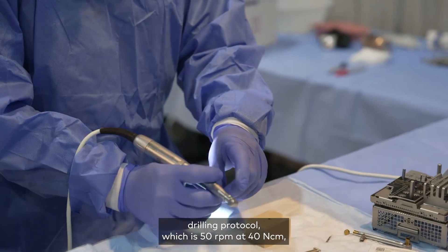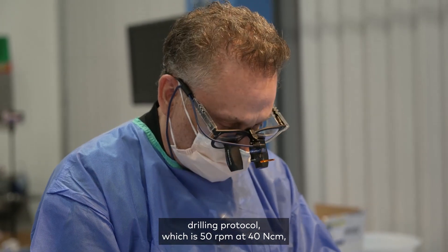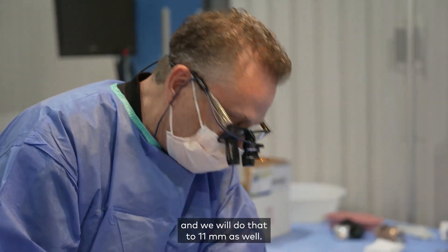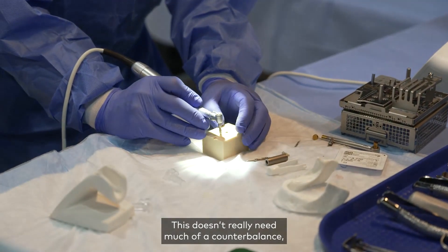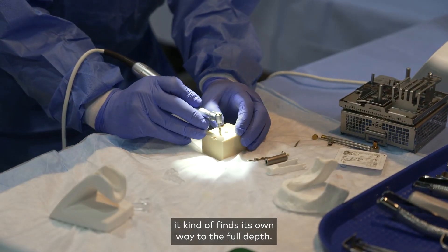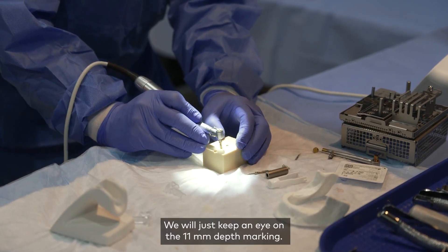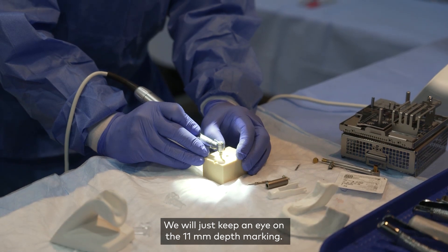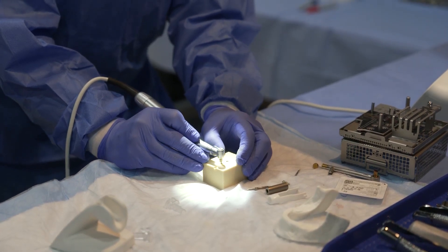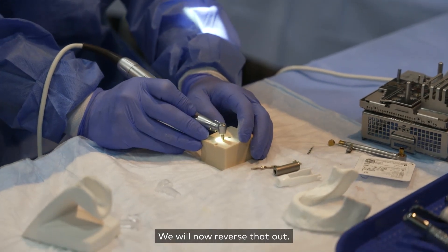We will set this for the osseo shaper drilling protocol, which is 50 revolutions per minute at 40 Newton centimeters, and we'll do that to 11 millimeters as well. This doesn't really need much of a counterbalance — it kind of finds its own way to the full depth. We'll just keep an eye on the 11 millimeter depth marking, and now we will reverse that out.